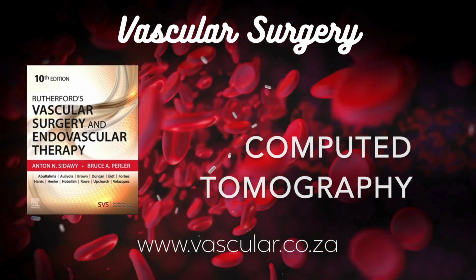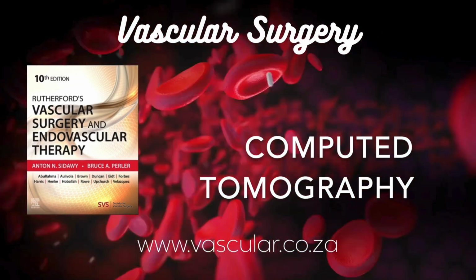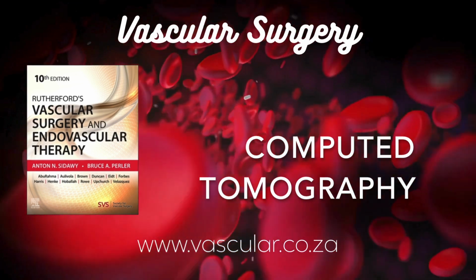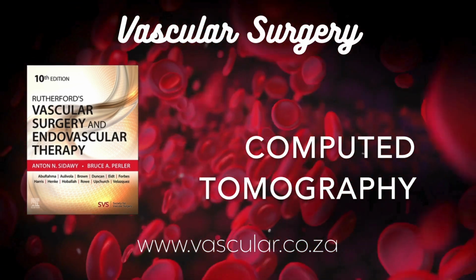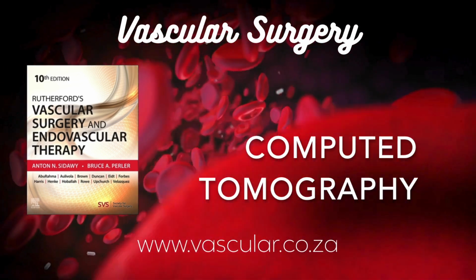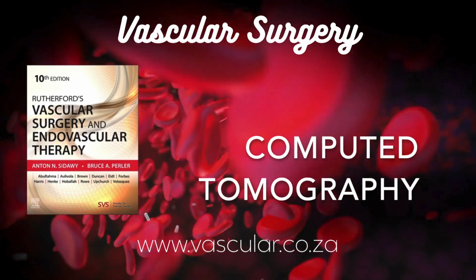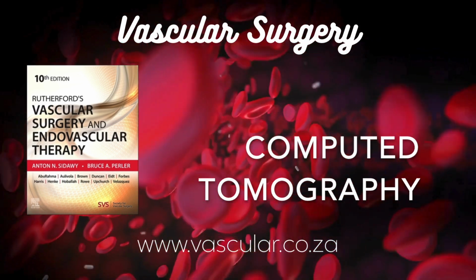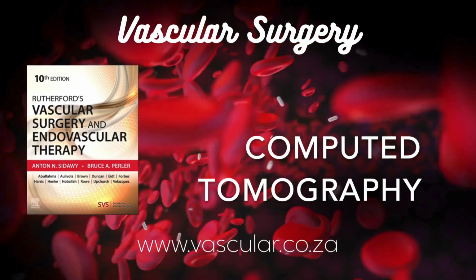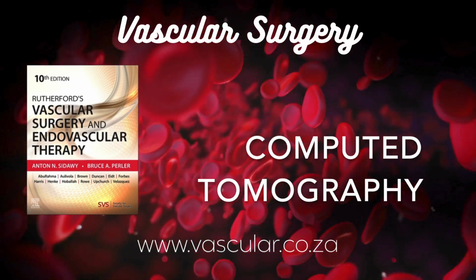Okay, so the computer calculates an HU value for every little spot in the slice. How does that become the black and white image we see? The computer essentially creates a grid, a matrix representing that slice. Each tiny square in the grid is a pixel, a picture element. Right. And the computer assigns a shade of gray to each pixel based on its calculated HU value. High HU values, like bone, get mapped to white or very light gray. Low HU values, like air, get mapped to black. And everything in between gets shades of gray. So it's basically a density map translated into a visual image. That's a perfect way to summarize it.